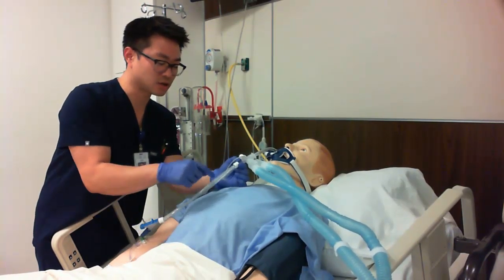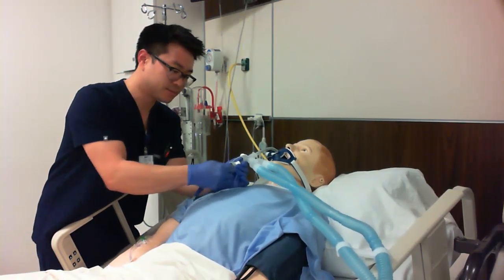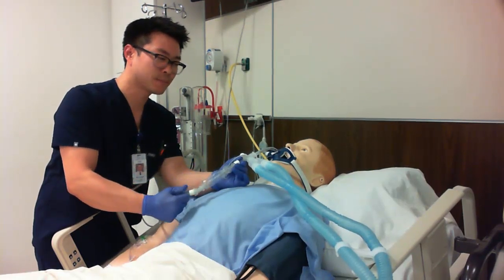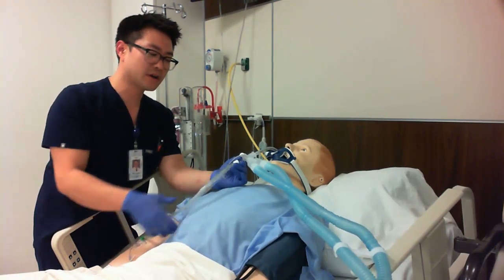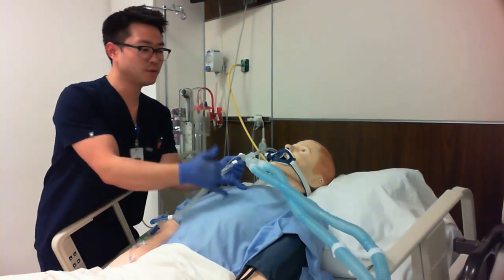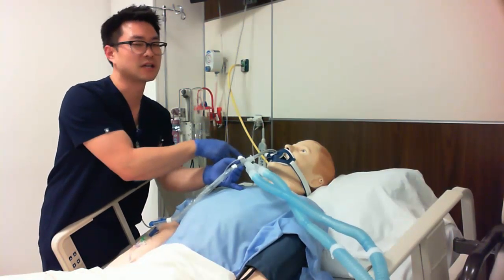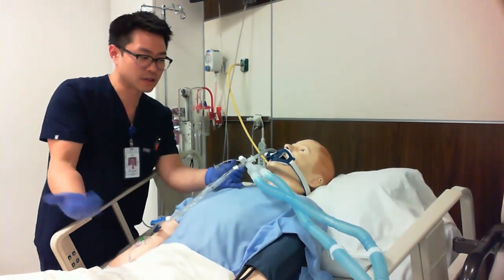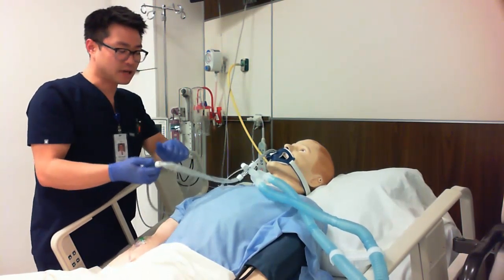So again, I'll show you as a demonstration. I'm holding the T-piece. Feed that through really quick. Got that in there. On and off, intermittent suctioning, 10 to 15 seconds. As a rule of thumb, if you want to use that 10 to 15 seconds, great. Also hold your breath, because if you cannot breathe or you're getting short of breath while you're suctioning, most likely your patient is too. That's always a practice that I carry with me that I received from my clinical professors. Okay, so that suctioning process is done.